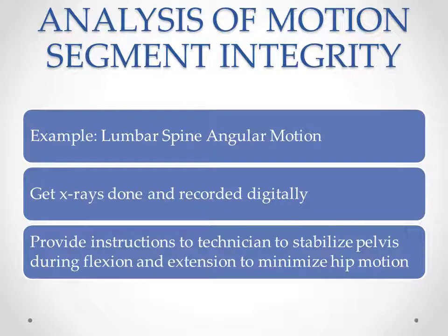And it's also important to note that you may have a deposition on this particular patient, and you may be asked in the future, well, what did the studies show? Or you may be asked to demonstrate how you came up with your conclusion that there was a loss of motion segment integrity, or that there was a spinal anomaly, or whatever. I'm just using this as an example. And the images upon which you rely have to be perfect. Insist on perfect images. So get them done at a local facility where they have $1 million equipment and everything's digital.